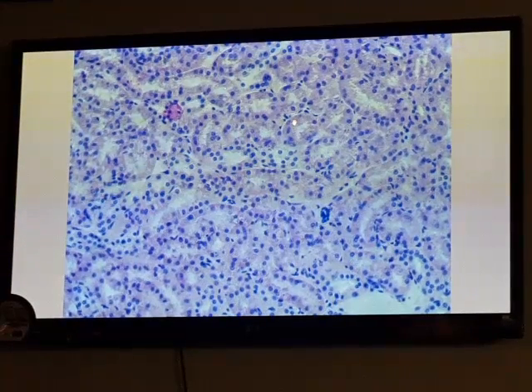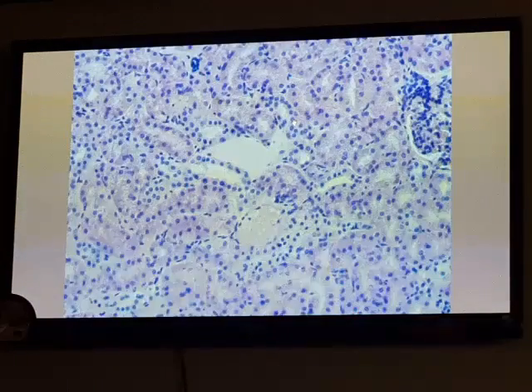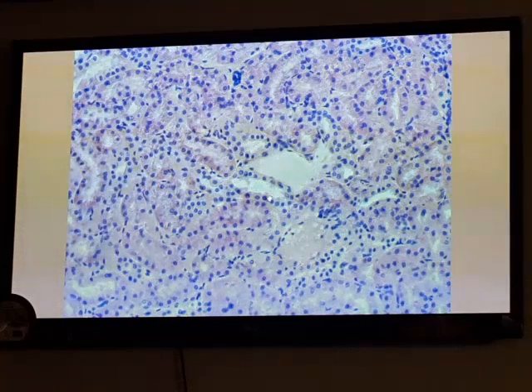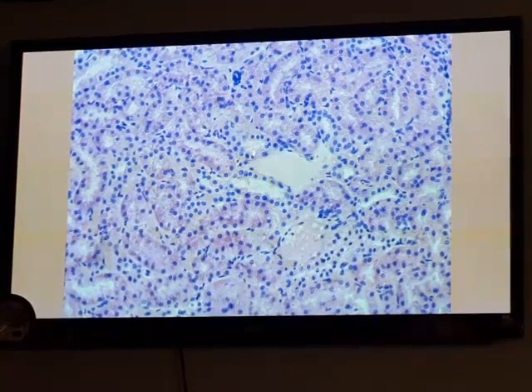Distal convoluted tubule cells are smaller than proximal convoluted tubule cells, with a wider lumen without a brush border or striated border, and lightly staining cells.